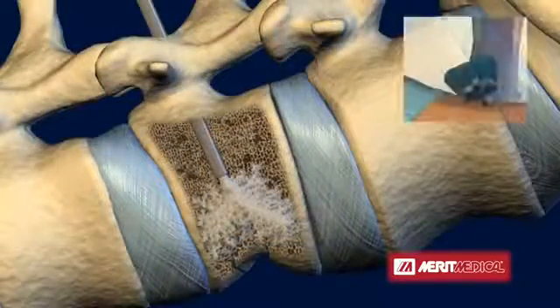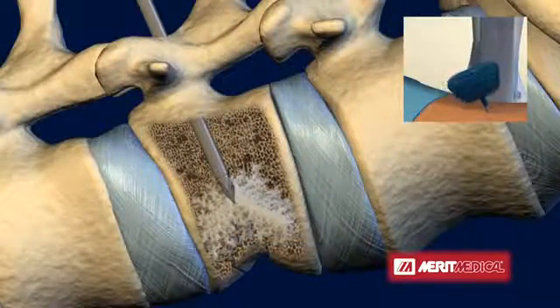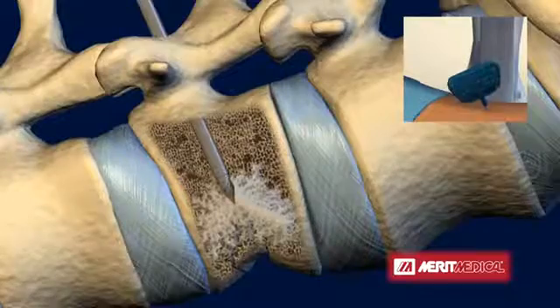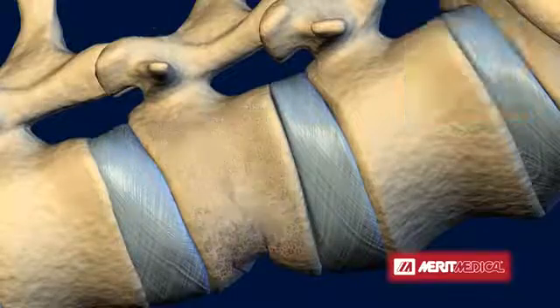Once cement delivery is complete, the delivery cannula is removed and a stylet is reinserted prior to instrument removal and wound closure with a small bandage.